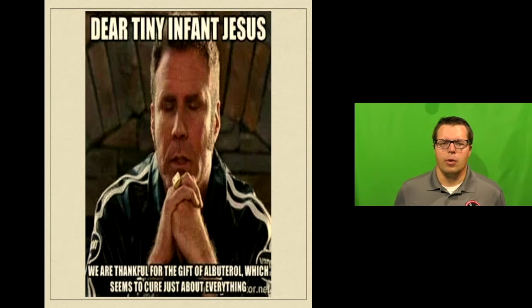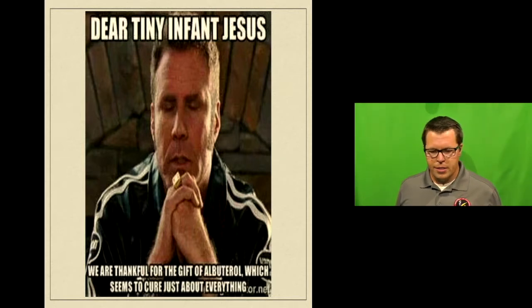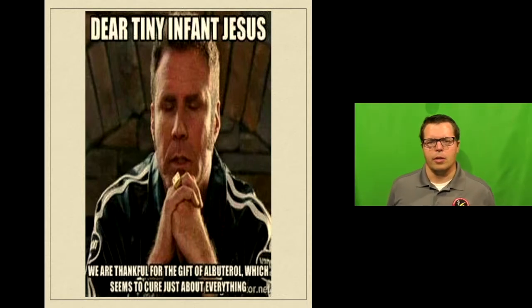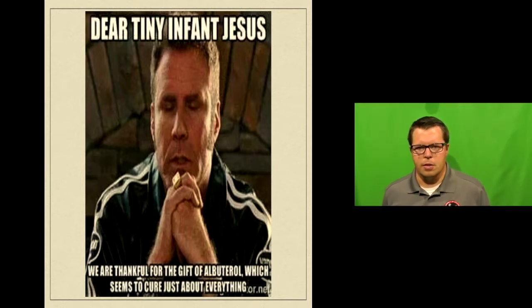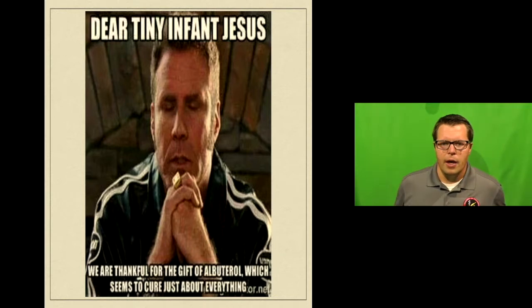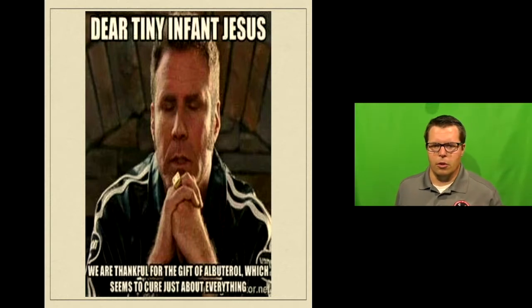Keep in mind, too, that putting somebody with obstructive lung disease on a ventilator doesn't fix the problem with their obstructive lung disease. Putting somebody with pneumonia or bad CHF on a vent may help to fix that problem or at least temporize things for a couple of days. Putting somebody with bad obstructive lung disease on the vent doesn't really fix the problem. It just offloads their diaphragm, which is getting tired.